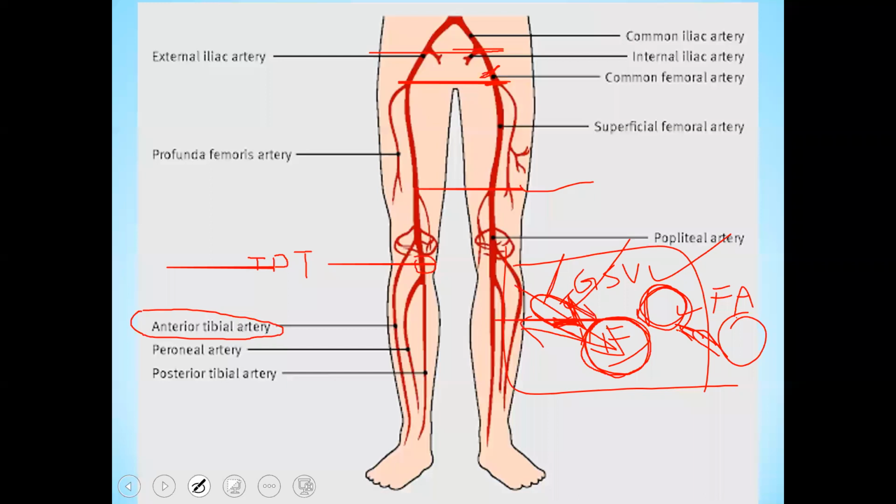You can make this angle manually. While having an angle of insonation less than 90 degrees, you then have to perform electronic steering of the beam as well.